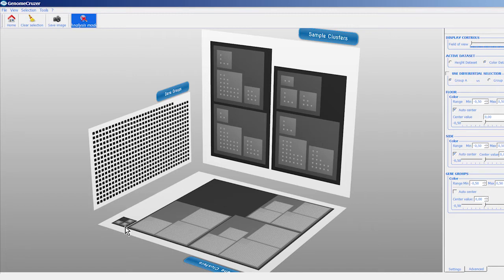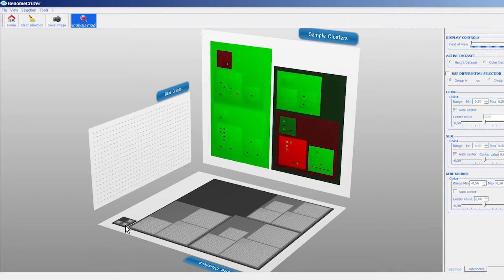To do this, we can select, for example, the MSI status, and immediately its values are plotted across all patients. In particular, green patients are endowed with microsatellite stable status, while black patients display a low level of microsatellite instability, and red patients are endowed with a high level of microsatellite instability.